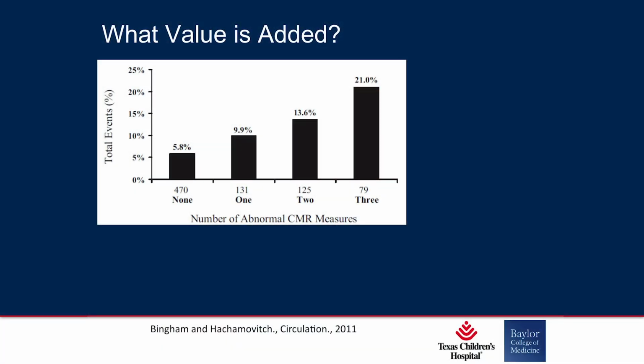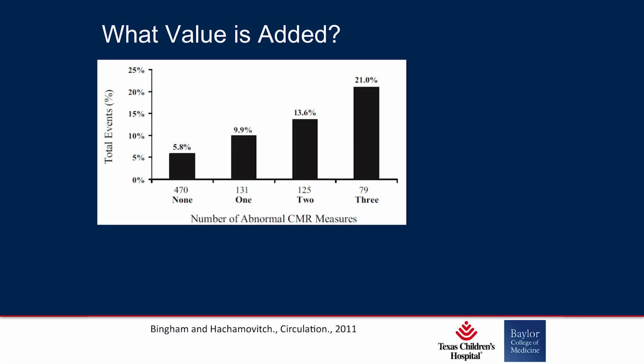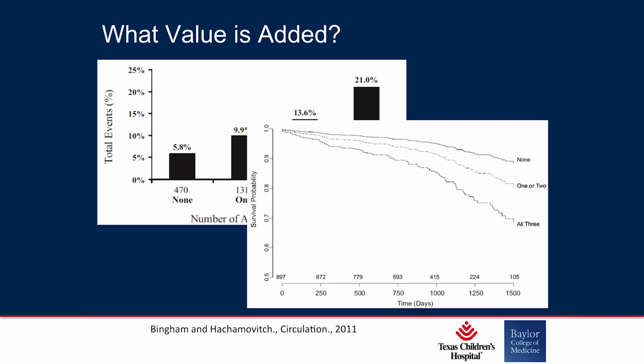In terms of MRI, this was a follow-up that was performed in Circulation, looking at MRI adding to your prediction of cardiac events. They used several different criteria that you can gain by MRI: an LV ejection fraction less than 50%, the evidence of delayed enhancement, which we heard about earlier in one of the previous talks, as well as abnormal perfusion. Obviously, if you had all three of those, it's common sense that you're much more likely to have some sort of cardiac event, but you can see here a quantitative stepwise increase: when you have that additional information gained by the MRI, the likelihood of having a significant coronary event is significantly increased.